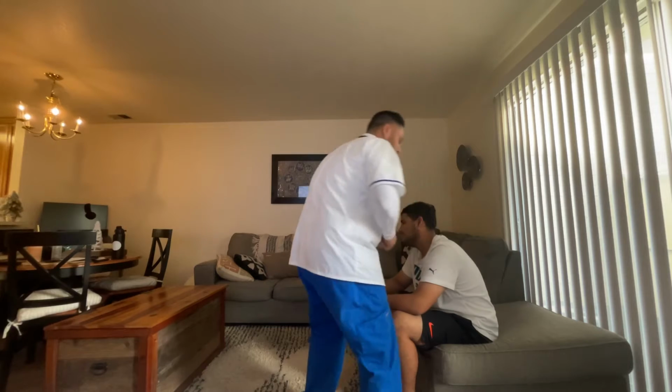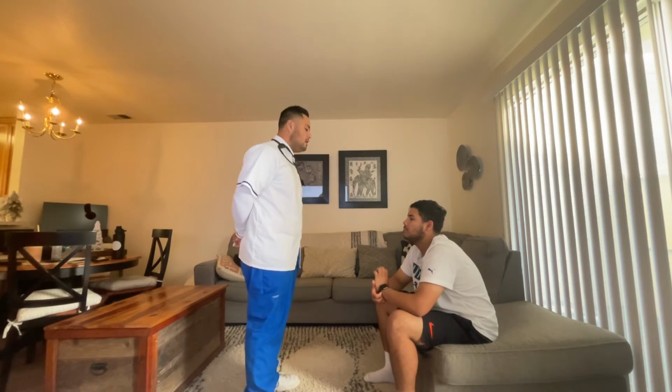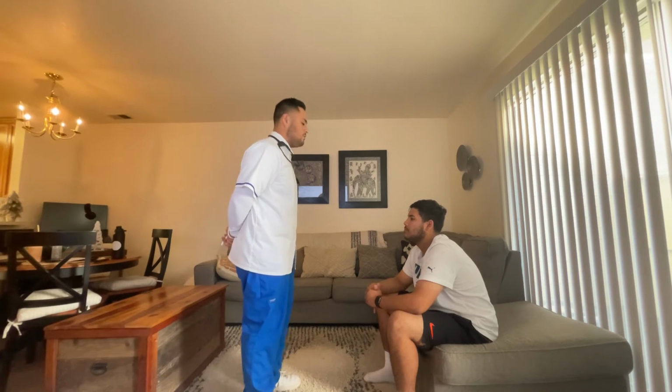Inspection of the tympanic membrane. It is white, pearly, transparent with no signs of perforation, redness, swelling. And then the cerumen in my patient is yellow and oily, as consistent with his ethnicity. The cone of light on the tympanic membrane shines at the 7 o'clock because of his left ear. It would be 5 o'clock on his right ear.